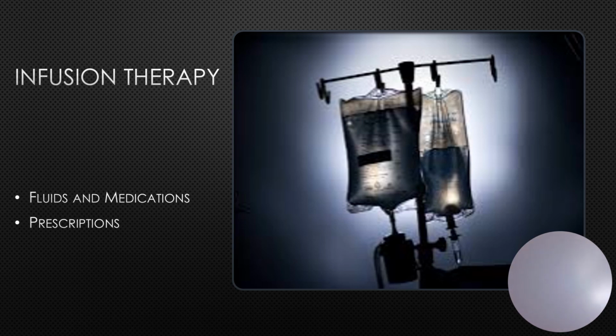Always be aware of the types of fluids and the expected outcome, and always verify compatibility of fluids and/or medications. Incompatibilities can cause precipitates in the fluid or a change in the action of the medications. If we have the precipitates, that can create an embolus. Infusions can be administered, again, continuously or intermittently.